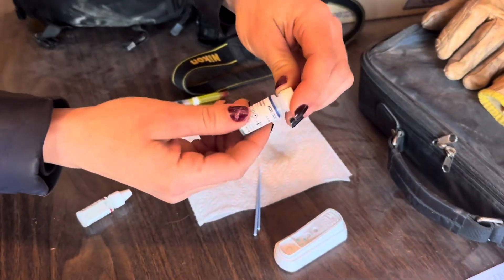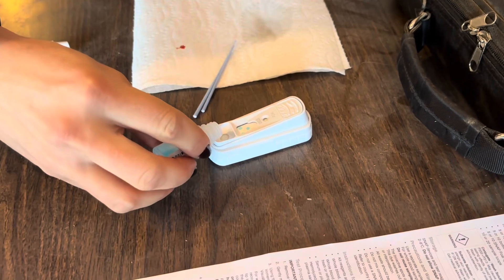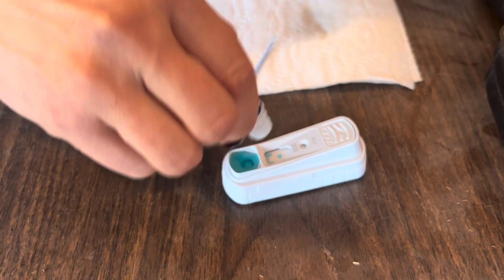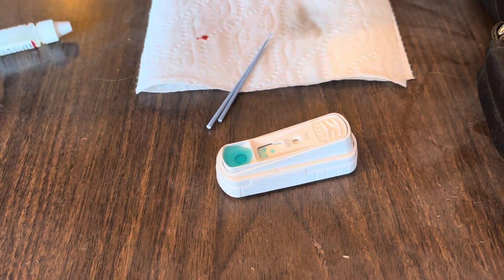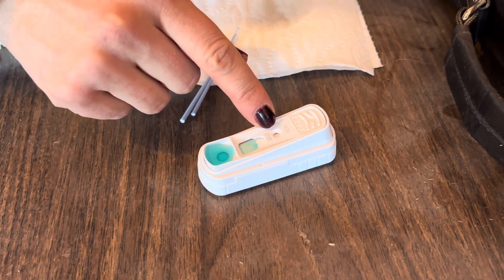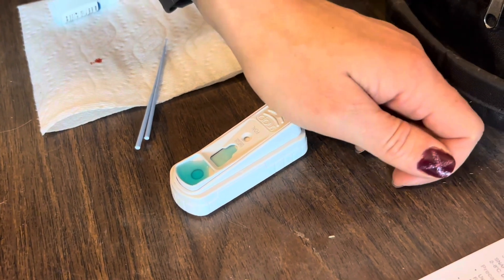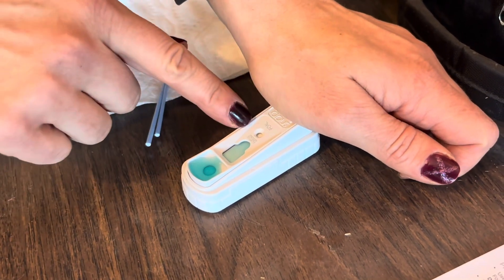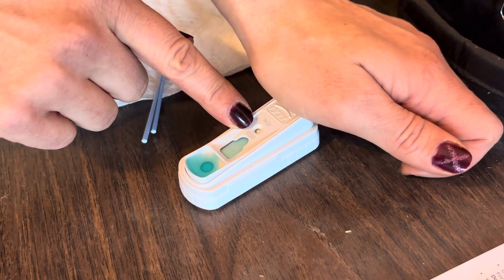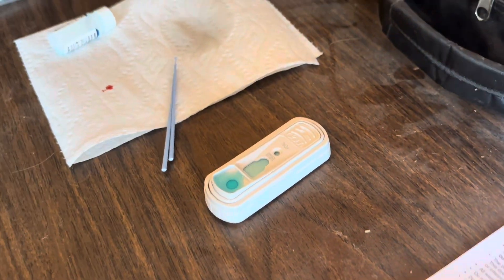You're going to take your conjugate and dump it into that window — dump the whole bottle, make sure the whole bottle goes in. Now that blue solution is going to come up here, and as soon as it gets to the very tip and starts coming into that full window, we're going to snap the test. This should be on a flat surface. It's coming into that window — snap — and we're going to wait seven minutes now.